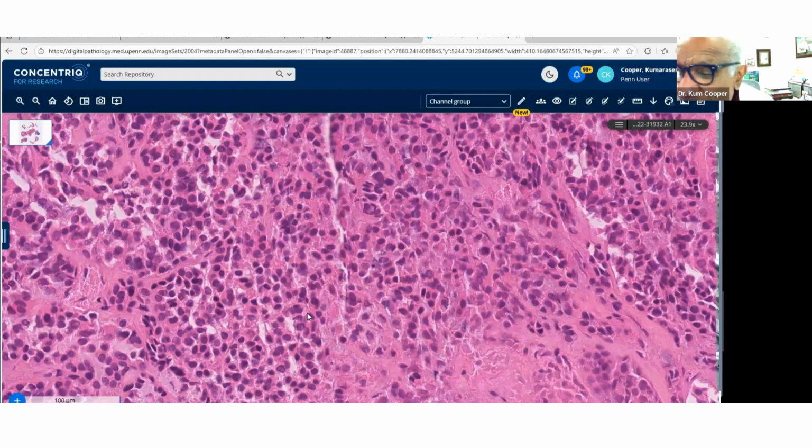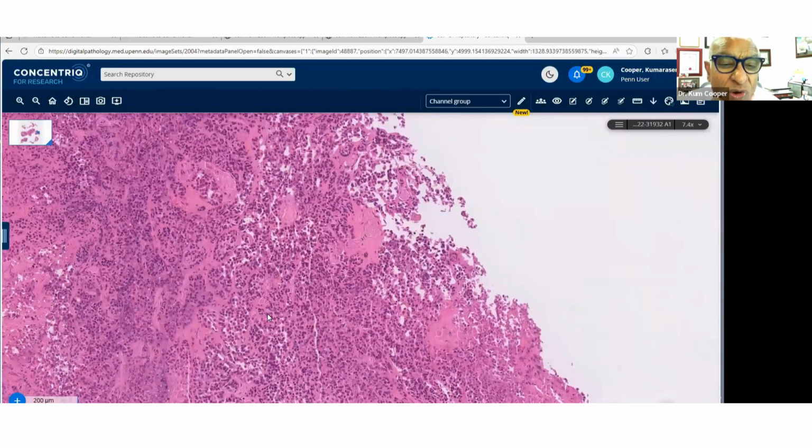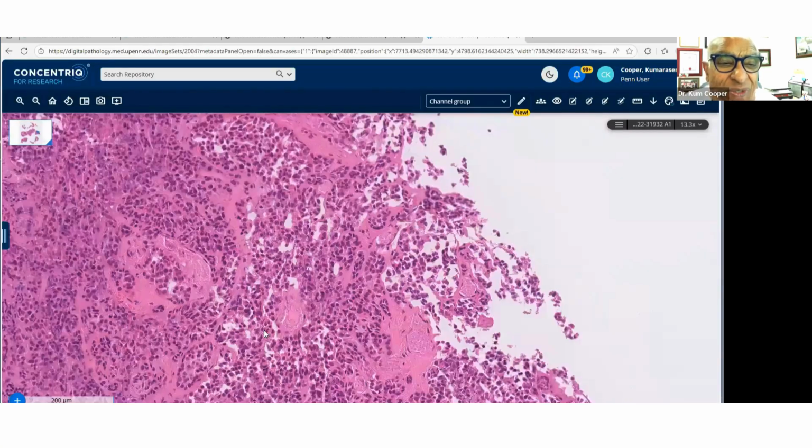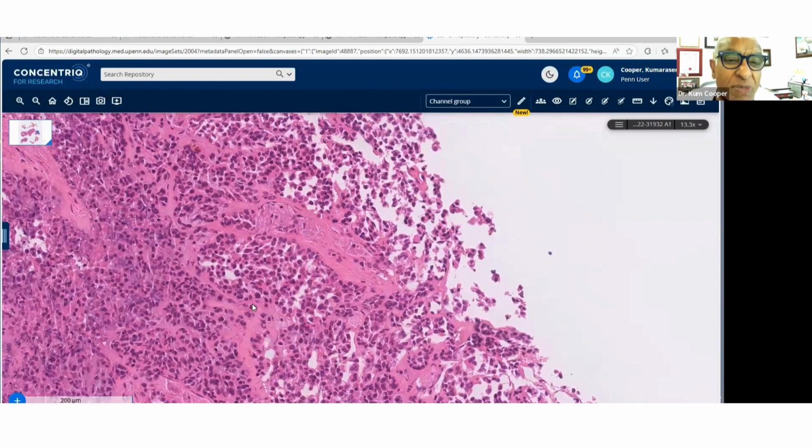I like glomus tumors come up there. That's a great start, glomus tumor. The only marker for glomus tumor is an SMA. So you probably ought to rule out all other glomoid lookalikes. That's a good thought. Glomus tumor does have a very nice glomoid pattern.